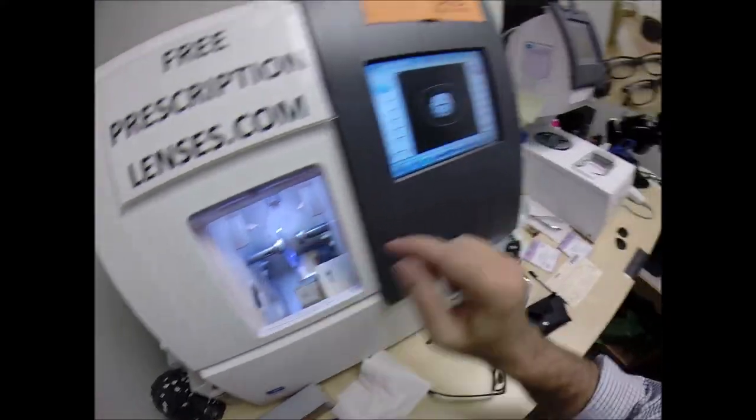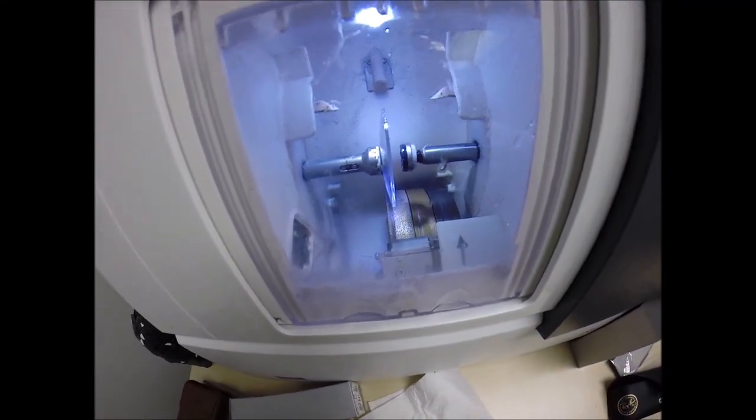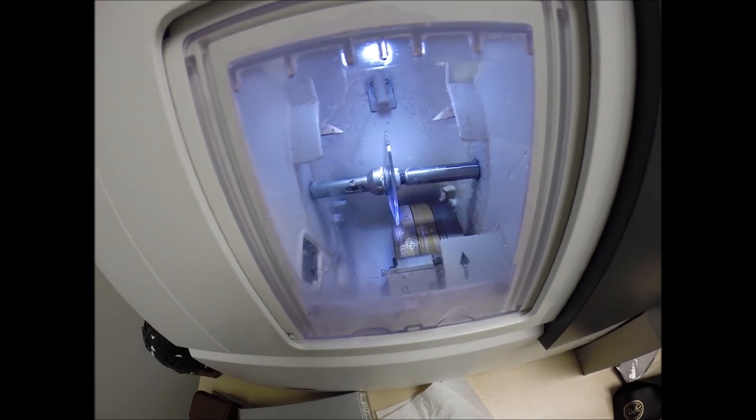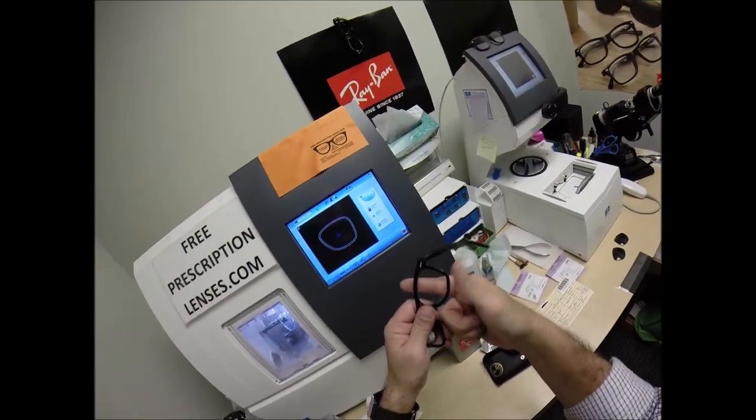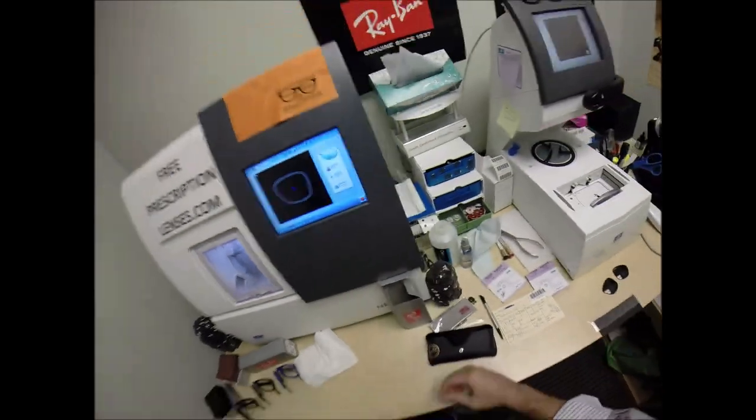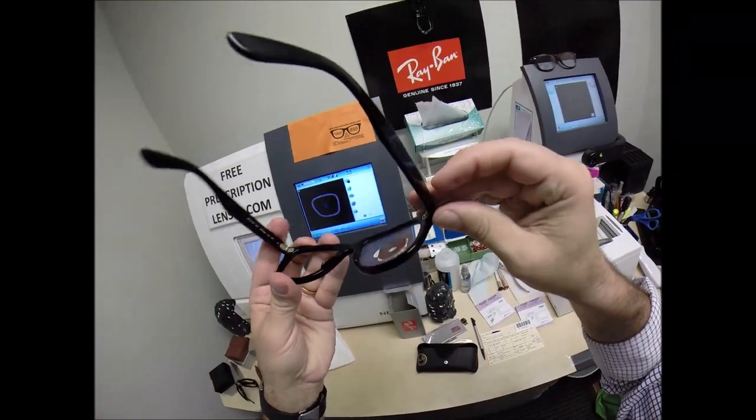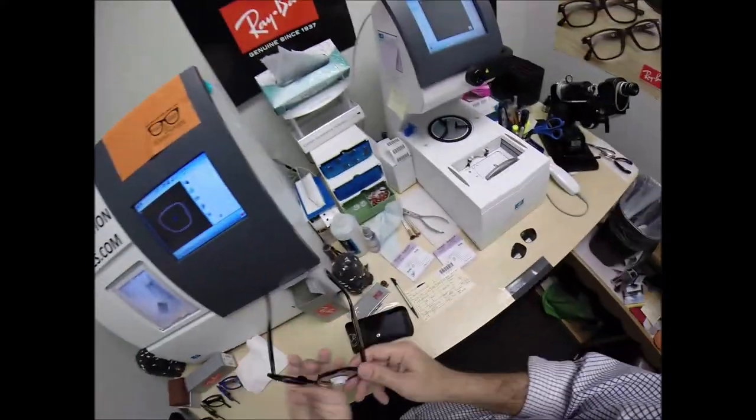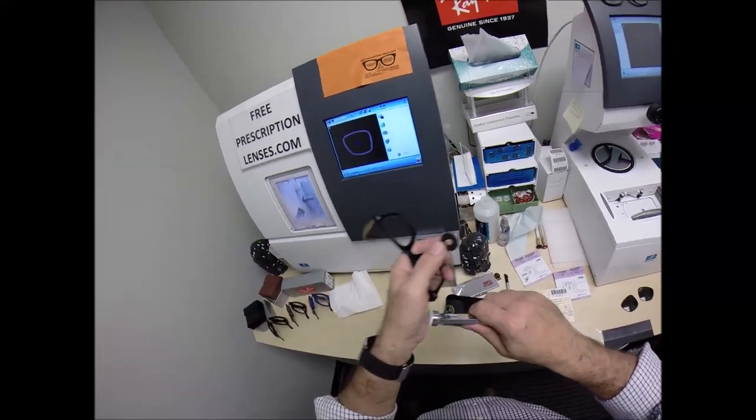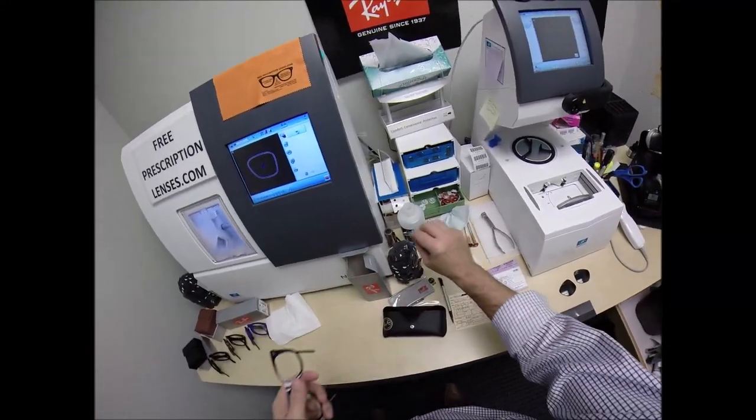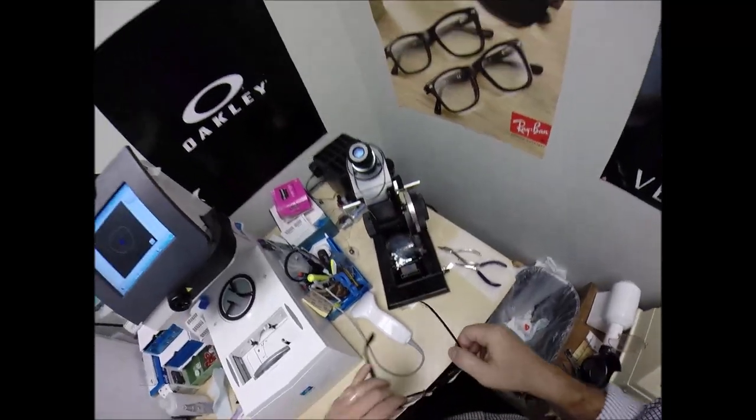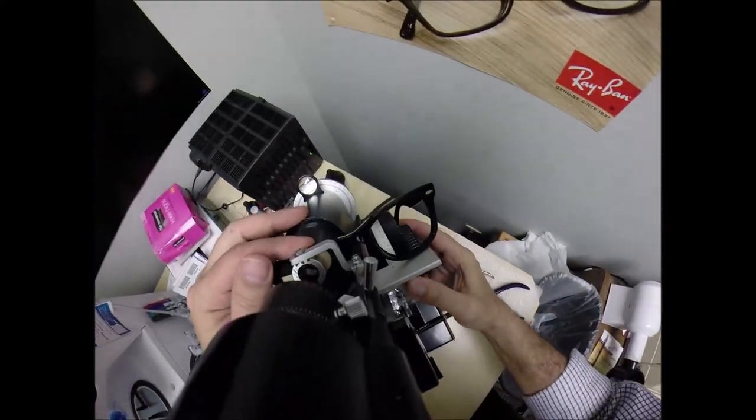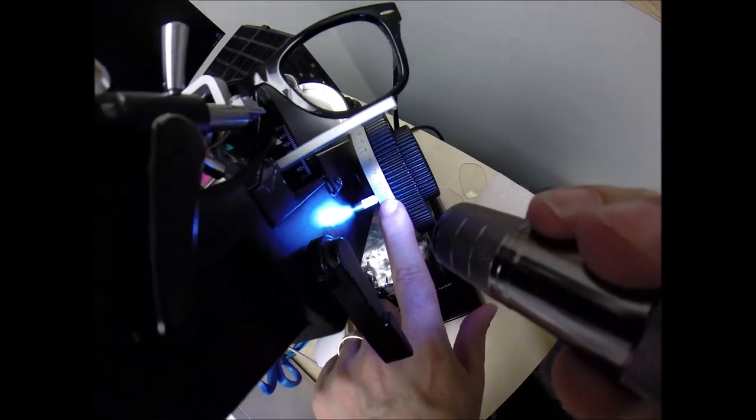We're going to do .30 on this side. Hit the green start button. Just like before, the door closes, the clamp shuts, and the lens is going to be traced by the two white styluses. That old carpenter saying measure twice, cut once. Take the block off, put the sticker on top. If these were prescription, I would come down here and read the power. I'm getting zero, no prescription.